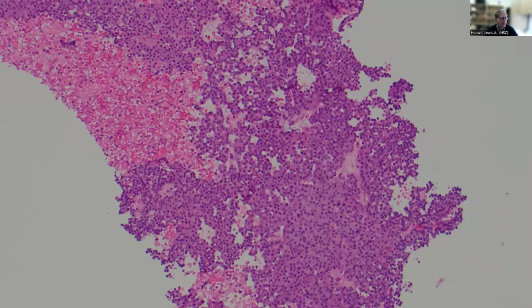As we hone in on a little higher magnification, I think we can begin to see that there's maybe a little bit of a lattice-like or lace-like pattern with small areas of tumor cells admixed with the obviously richly hemorrhagic background of the tissue area. And at higher magnification, you can see that, again, there seems to be a little clustering around a central microlumen or central acinus, perhaps, that gives this tissue a somewhat rounded and organoid pattern.